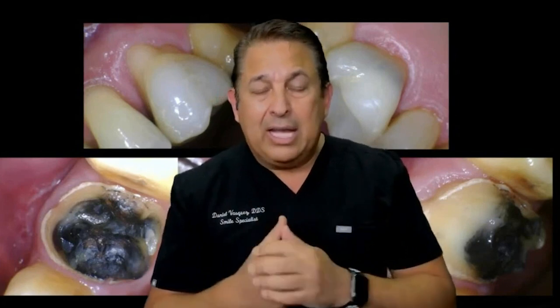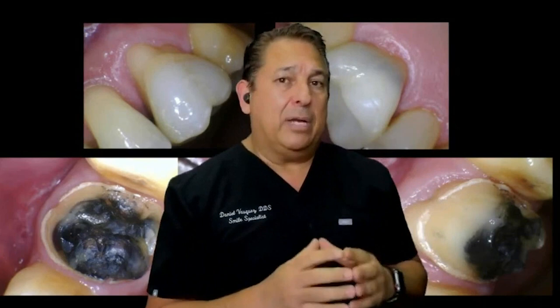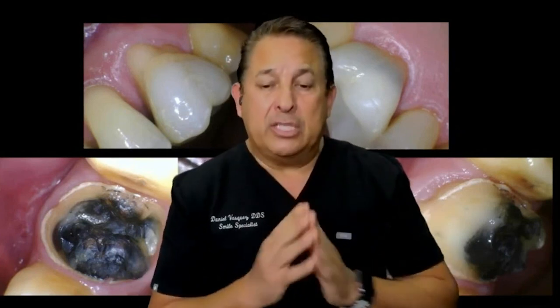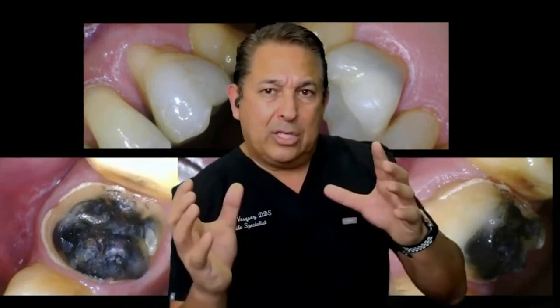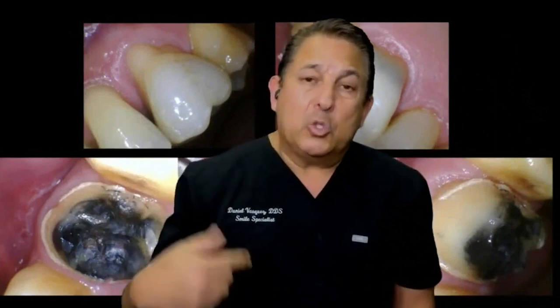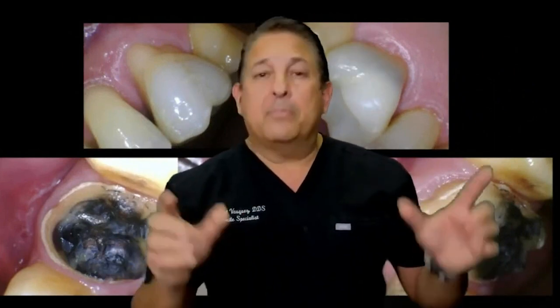Today I have modified preps and I'm using a technique that is called BOPT, biologically oriented preparation technique. I learned this technique from a group of Italians, a lab technician and a dentist who got together, and they went back to the old school of when we used to work with gold. The prep with gold, feather edge, the adaptation was perfect, correct? So today, with today's materials being so strong, we can use this kind of prep.